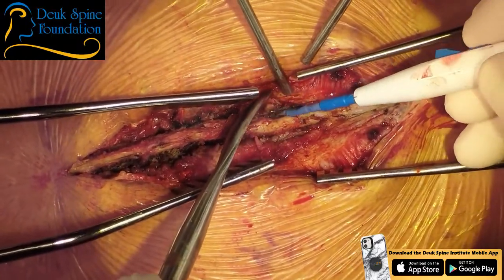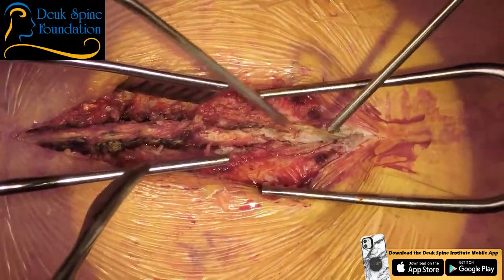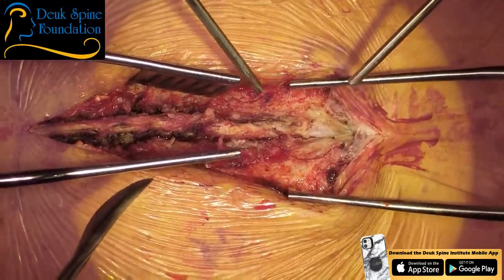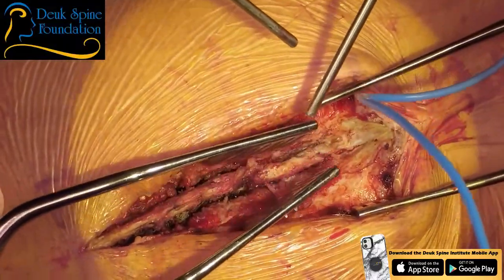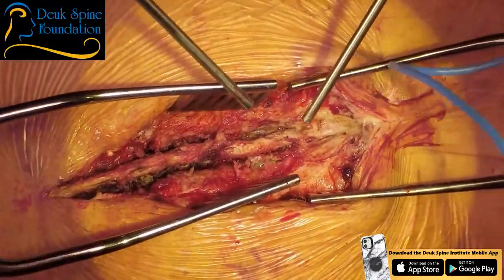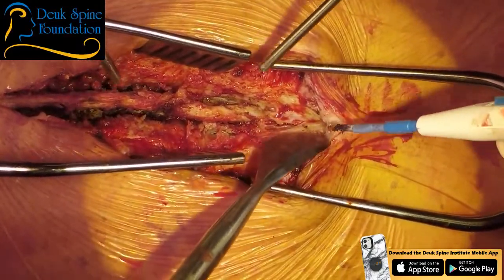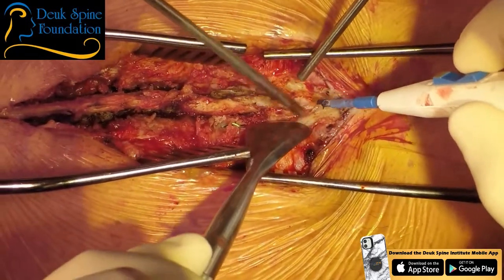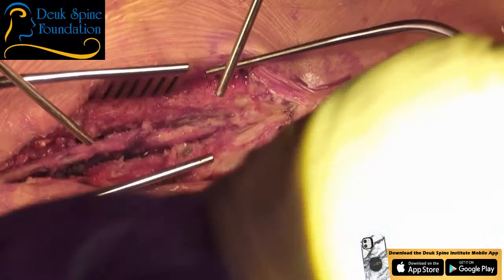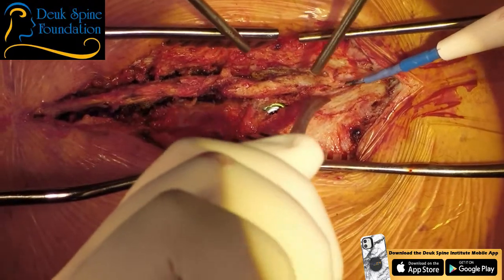So what's unique about this surgery for the viewers is this is not a virgin case. We call virgin case meaning a new case. This is a revision, meaning we have to go back in. And in this case, not where I operated, but just next to it. So the two bones or spaces, disc spaces above my old surgery is where we need to be. All right, I need a smaller cup. So we've got the back open. Our patient is laying down on their belly. And you can see the screw here from the old surgery.